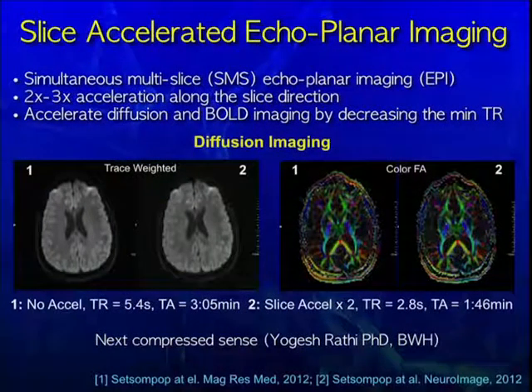Another thing that Dan brought up is the time issue. I collaborate a lot with the Martino Center, and if they want to understand, say, tractography, they'll just put someone in the scanner for an hour or 2 hours. But if we're running a clinical study, I can't ask what the optimal scan is. My question is, what's the optimal scan I can do in 5 minutes? Because I've got 5 minutes, and I just need to know how I can spend it best.